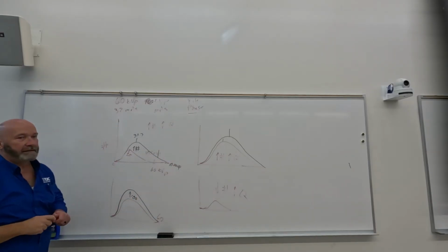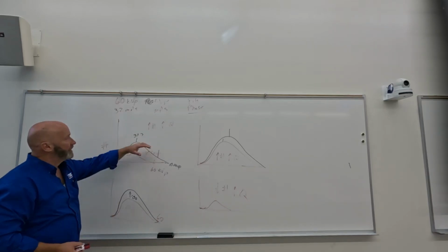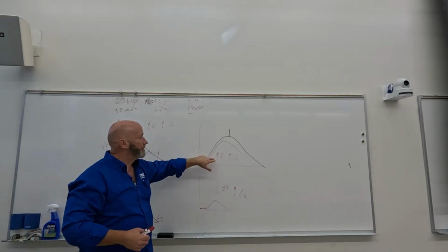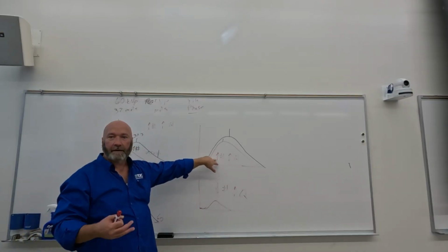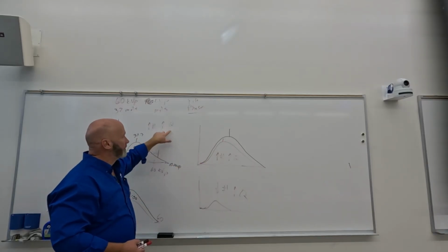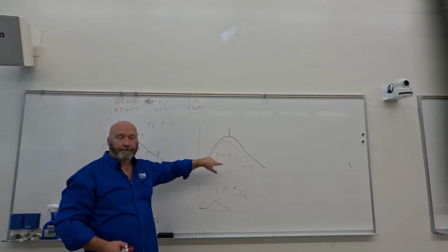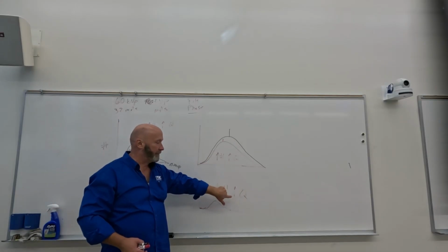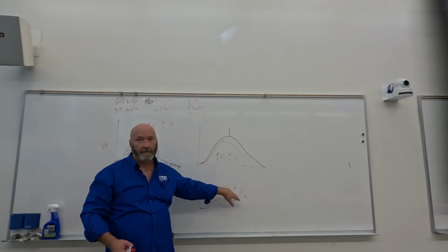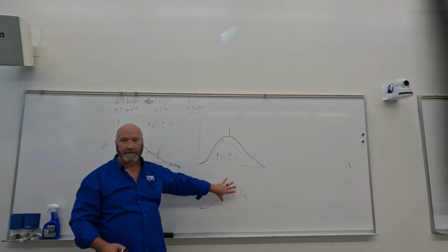So what you're going to have a tendency to do on the test is conflate all these things, all right? With an increase in kVp, you get an increase in numbers. Increase from single phase to three phase, you get an increase in numbers. With increase in kVp, you get an increase in quality. Single phase to three phase, you get an increase in quality. But once you get down to filtration, it flips just a little bit. With more filtration, you get more quality, but you get fewer numbers, okay? So this is going to be your sticking point on the test.